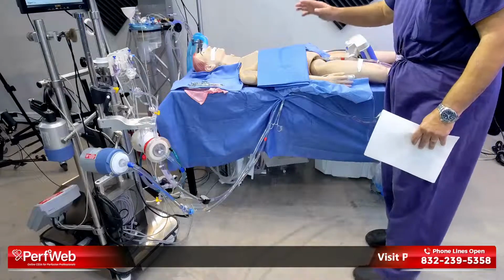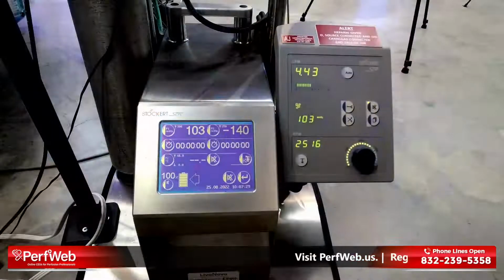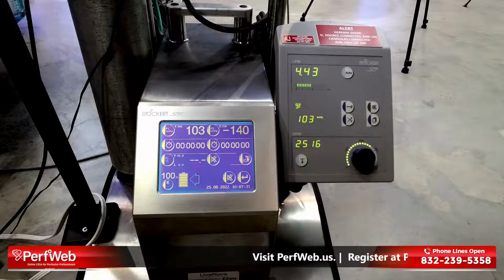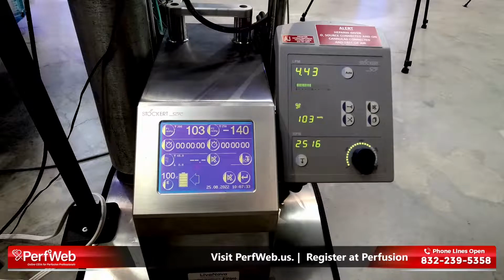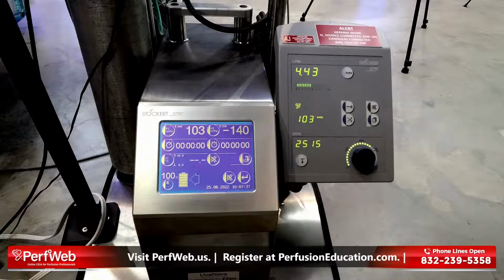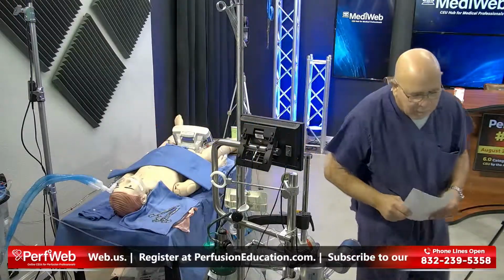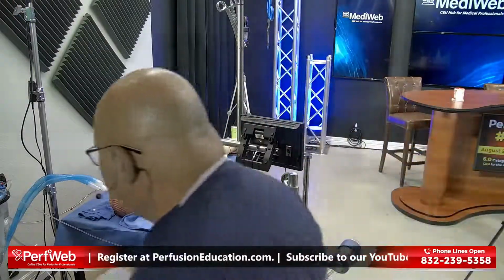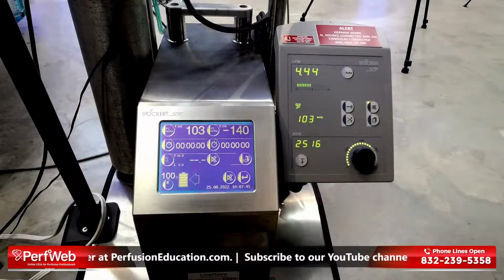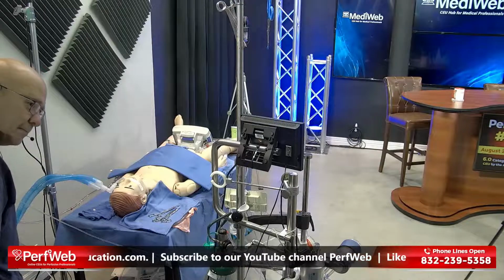And can you show our flow and things like that, the Mevo, on the ECMO circuit itself? So this is where you'll see the flow of the ECMO, and the access pressure and return pressures are demonstrated there. And then we'll go back to that Mevo, and I'll point out over here our actual ECMO simulator, which is from Curtis Life Resources, and this is the simulator over here. Are they able to see it?